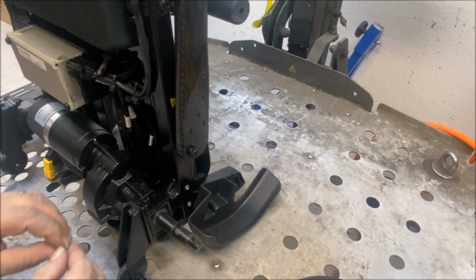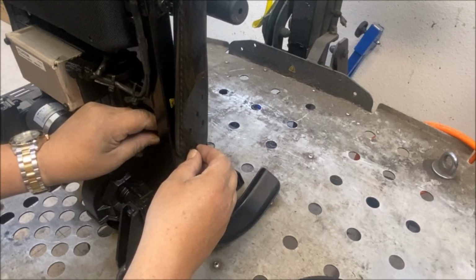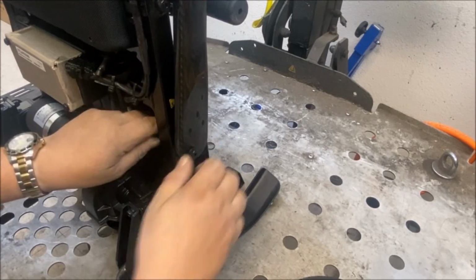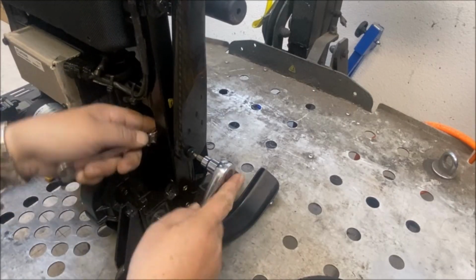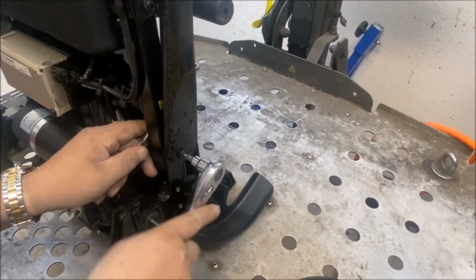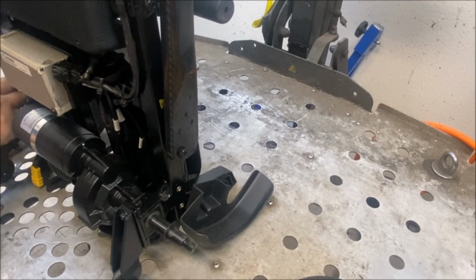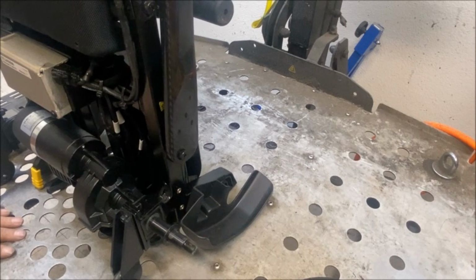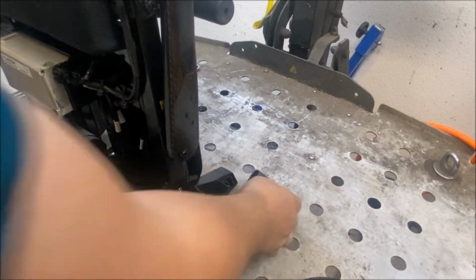Make that seated. Your washer and your acorn. That one was dying to go and cross thread itself. Yeah, not super tight. So that's that one. And now they're tight, I could put the fender liners back on, screwed in.